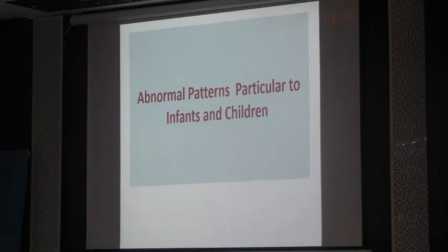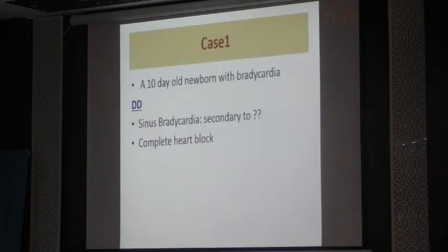Now I'm going to talk about abnormal patterns, particularly in infants and children, that maybe in adults you will not be seeing. Case 1 is a 10-day-old newborn with bradycardia. A newborn baby who has bradycardia. Is it sinus or a complete heart block?